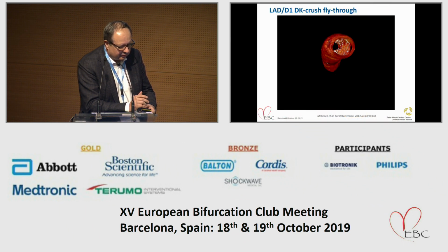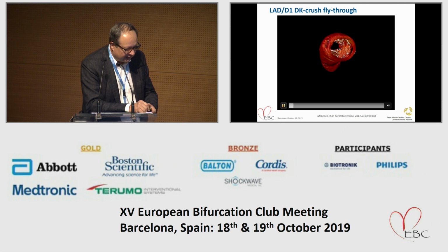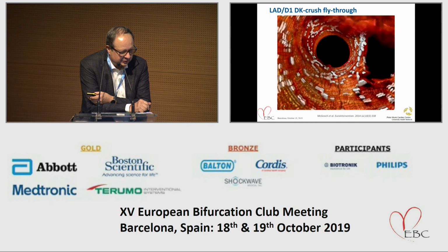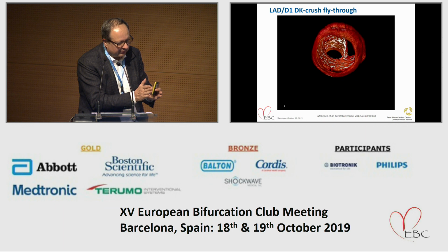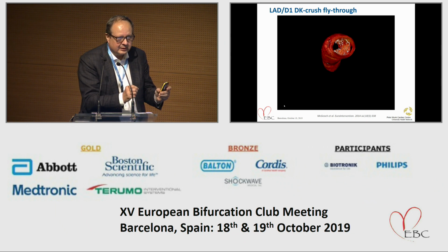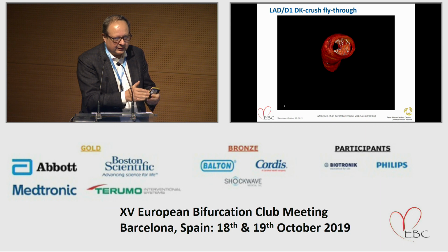This I've shown before, I'm sure, and of course it's not running again, so it is a little bit, okay, there we go. Just run it and we'll take a minute. Look at the carina, and at the very end when it starts to come back, there's some malapposition. I think this is because of the DK crush, because you are creating a little bit of a neocarina, and this will come up again, so you can see it later. There are malapposed struts at the carina, and potentially these could cause trouble in the long term. So I think this is actually inherent to the DK crush.